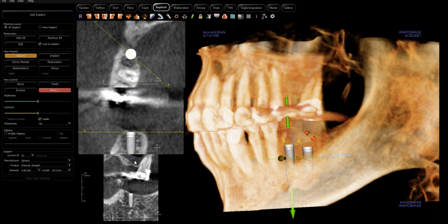You place the implant so that it's in an ideal position, and then you ask yourself, do I have sufficient bone to support the implant in that position? If you're very far away from it and you can't move the implant to kind of smudge it into place, then you're going to want to graft. That's kind of the take-home message.